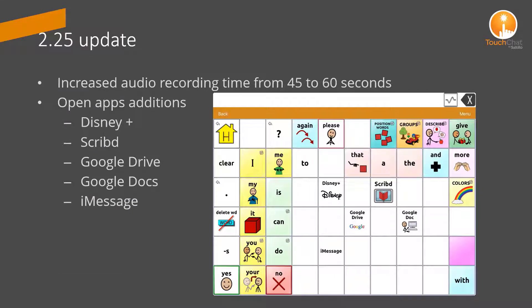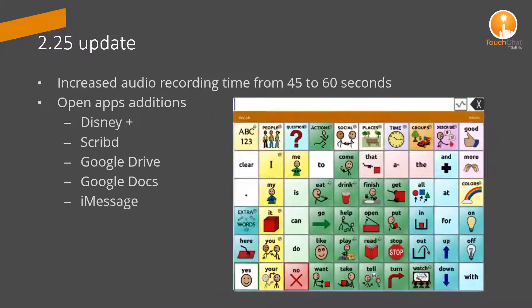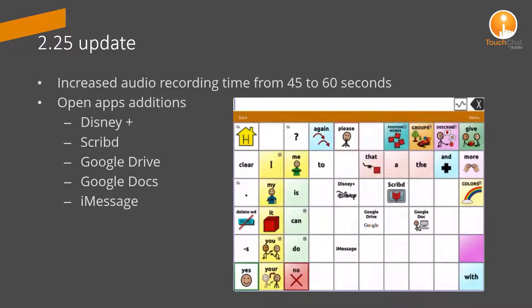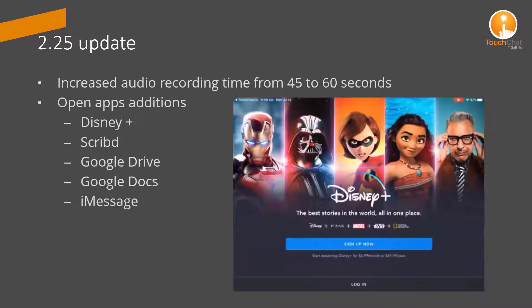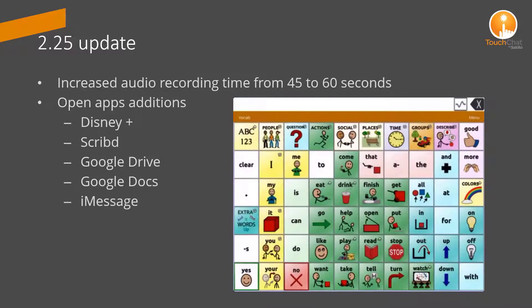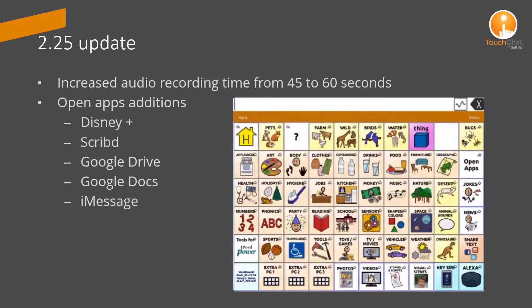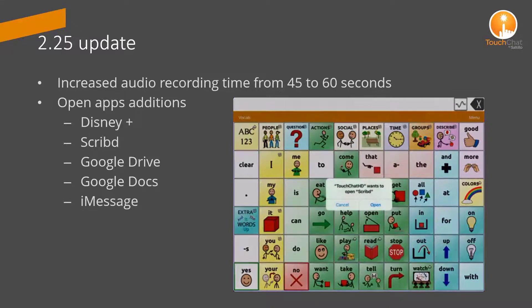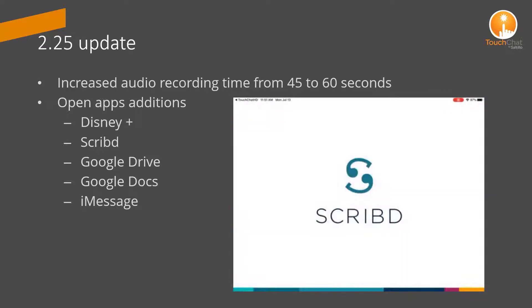A few more options have been added to the Open App Library. If you have the app installed, you can use the Open App button action to open the app within the vocabulary file. This video demonstrates a page created for open apps.